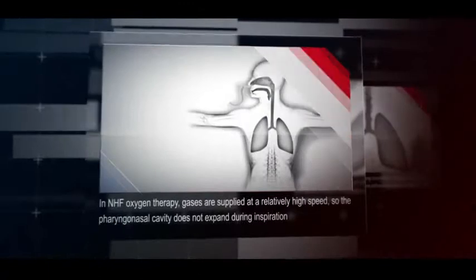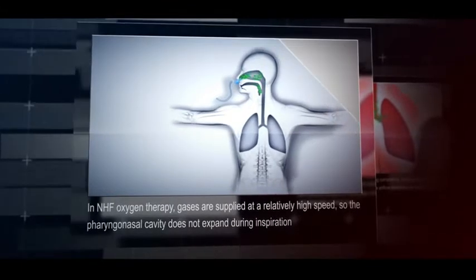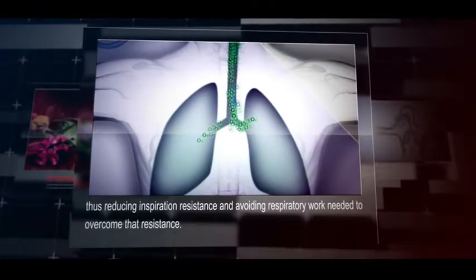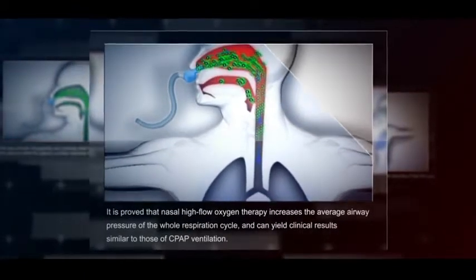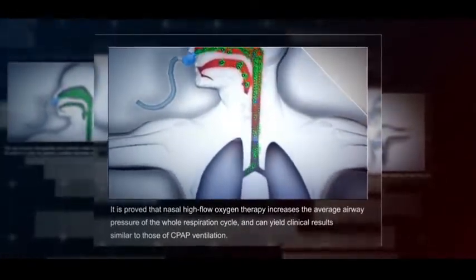In NHF oxygen therapy, gases are supplied at a relatively high speed, so the pharyngonasal cavity does not expand during inspiration, thus reducing inspiration resistance and avoiding respiratory work needed to overcome that resistance. It is proved that nasal high-flow oxygen therapy increases the average airway pressure of the whole respiration cycle and can yield clinical results similar to those of CPAP ventilation.